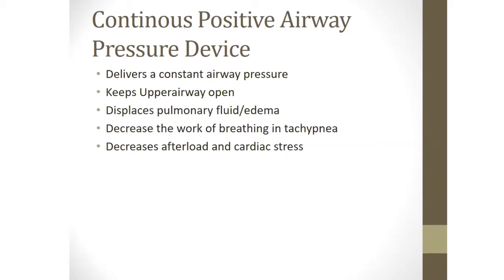Most commonly we use CPAP in pulmonary edema, whether cardiogenic or non-cardiogenic. The next absolute indication is obstructive sleep apnea, where there is closure of the upper airway because of the relaxation of the tongue and soft tissue muscles. Next slide, please.